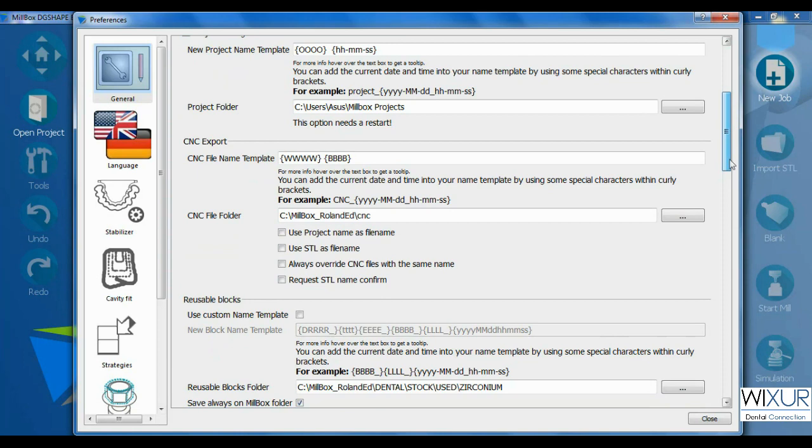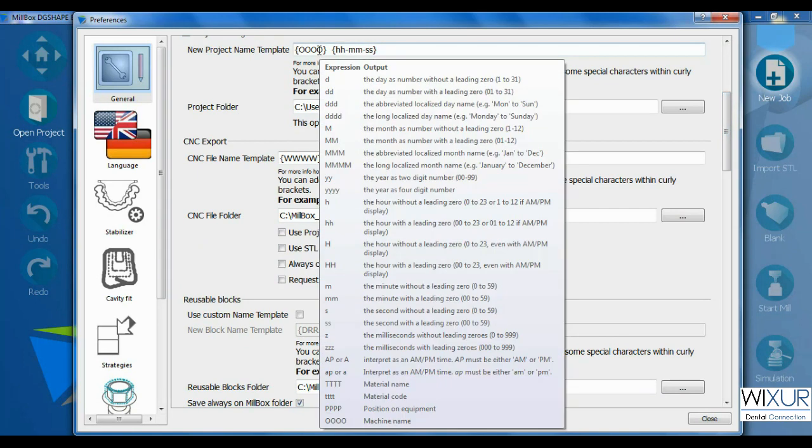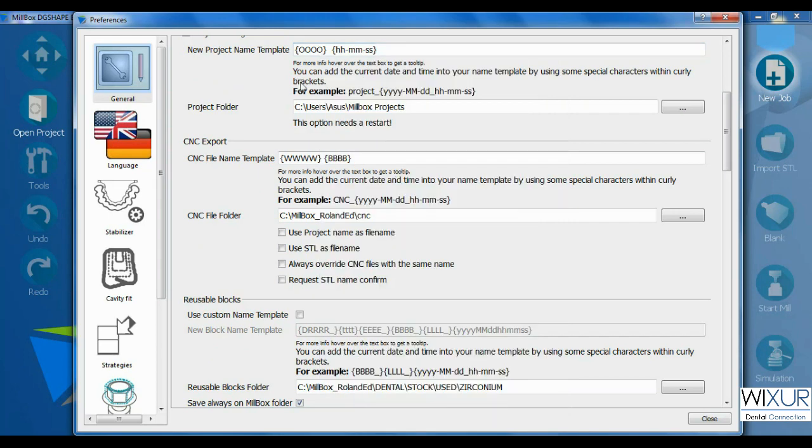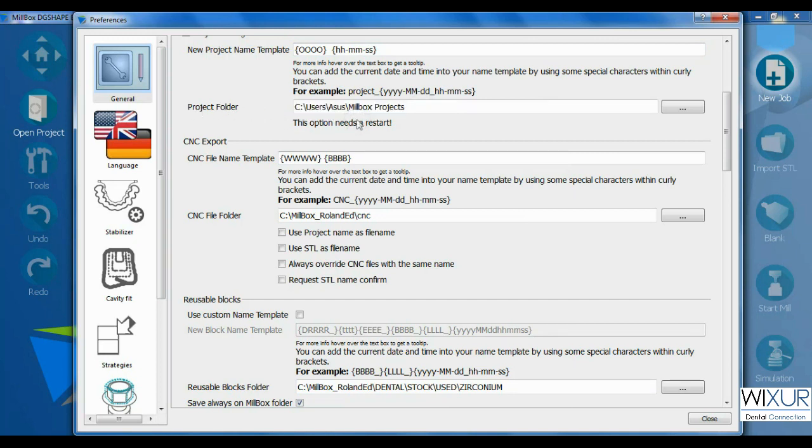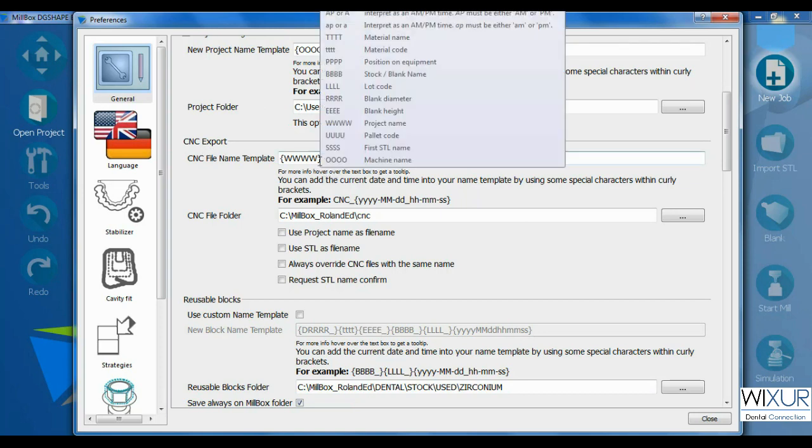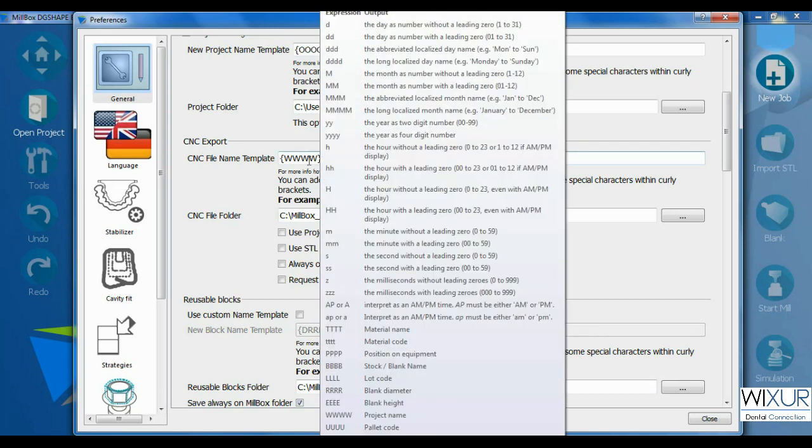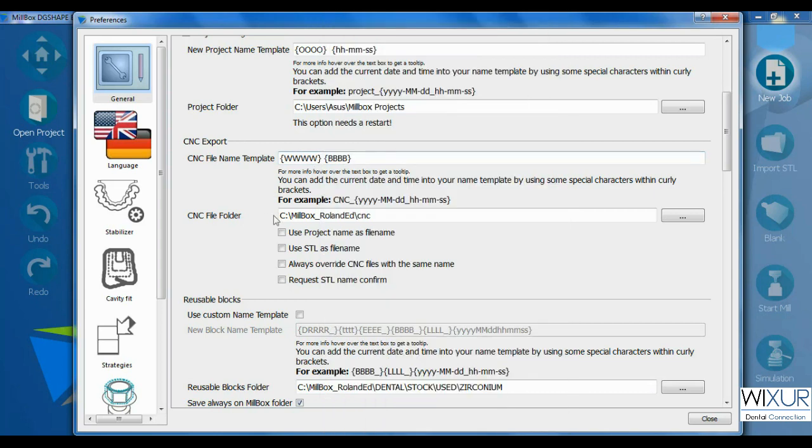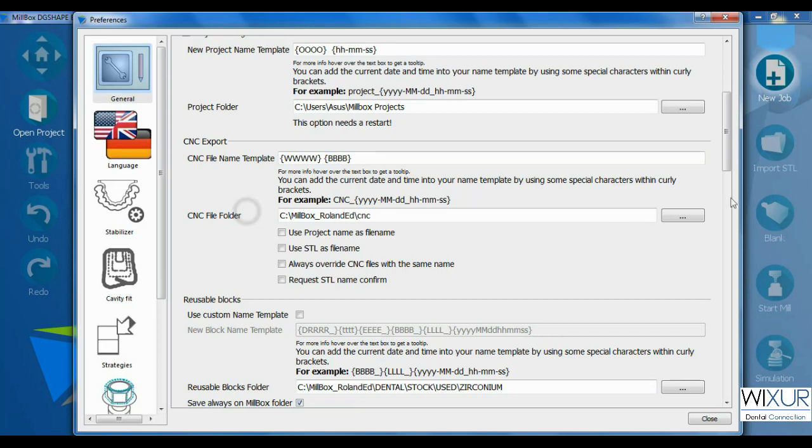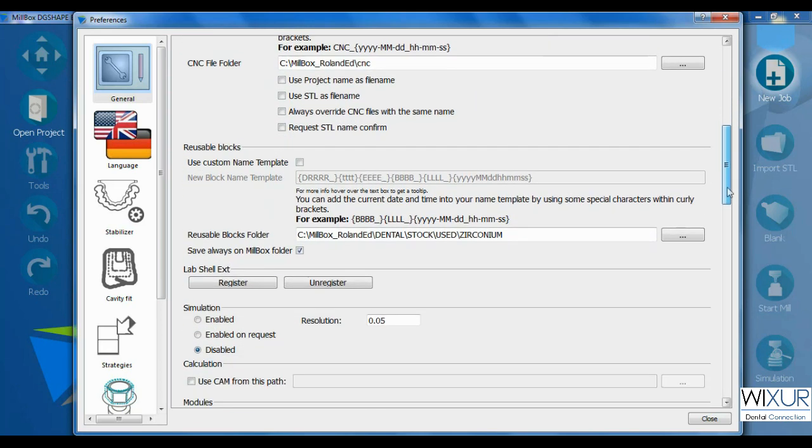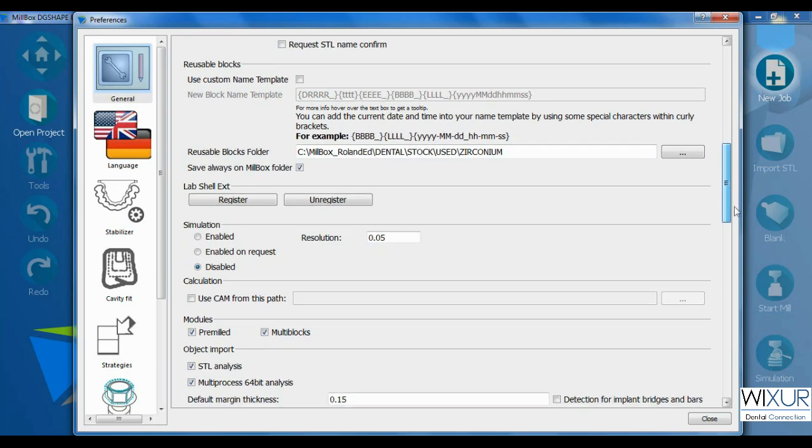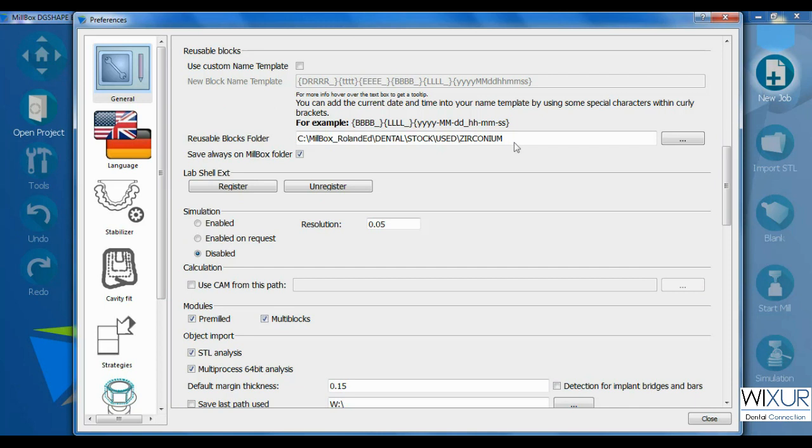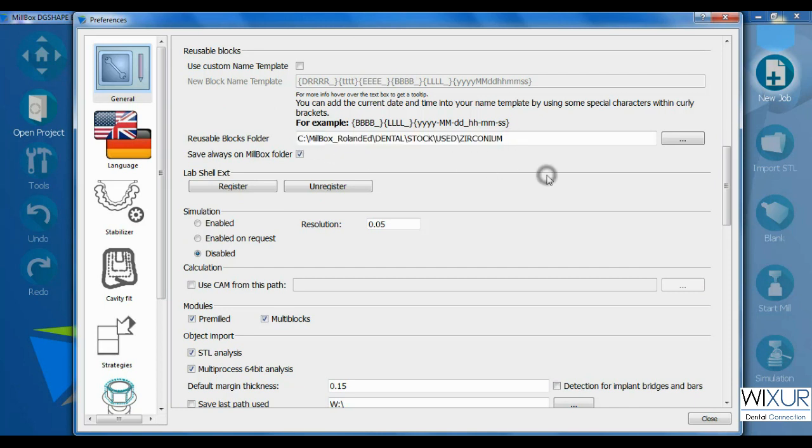Project folder indicates a location of saved jobs in CNC exports. Here are two tabs dedicated for file names and their locations. The location of used blanks that are saved in mailbox can be changed here.